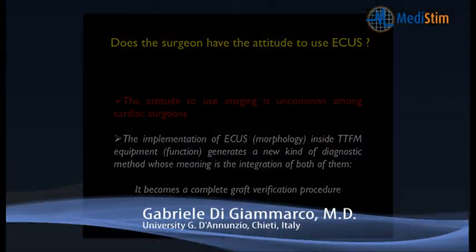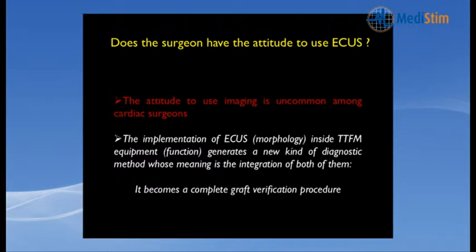This is another important question because, in my training period, I used to do vascular diagnosis by means of Doppler, continuous wave Doppler, and then color flow mapping and 2D and so on.